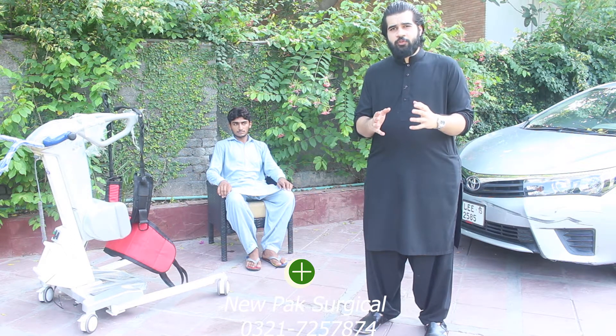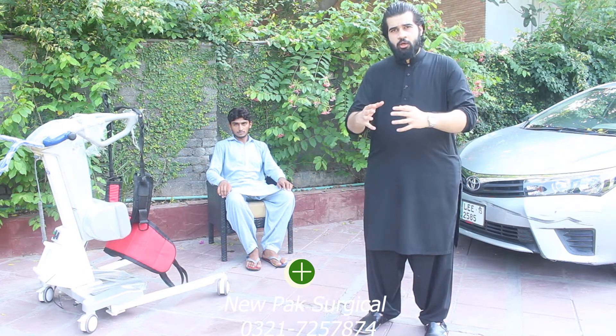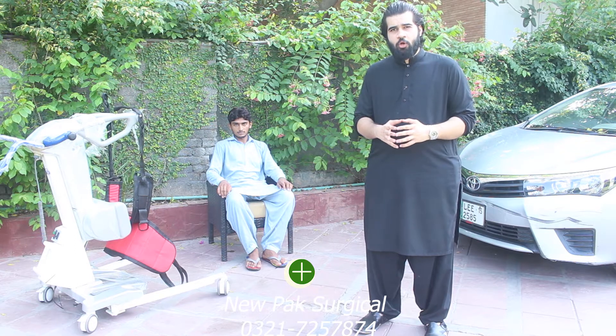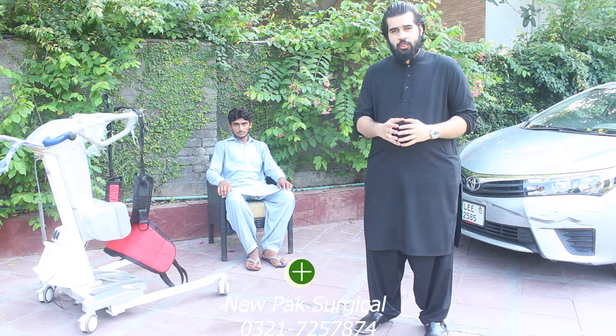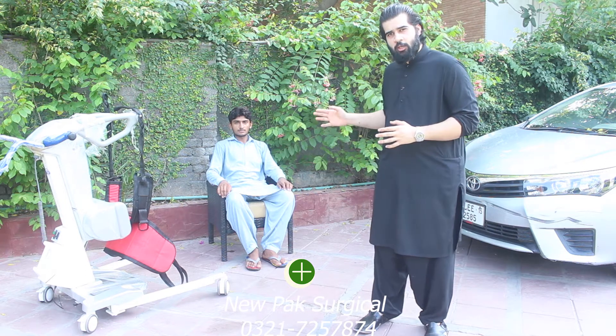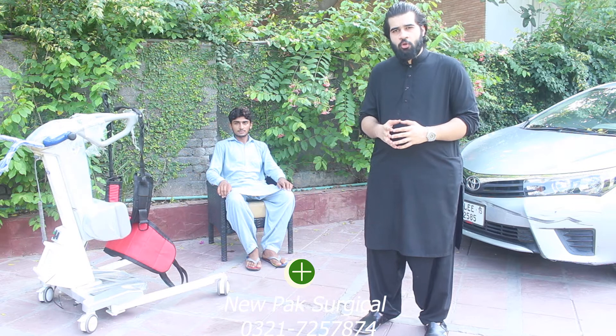We will tell you how to use this lifter with the sling and harness — we attach the patient and we can transfer the patient to the car. Today we are with Tamar, who will help us through this process. I hope we can answer any questions you have.